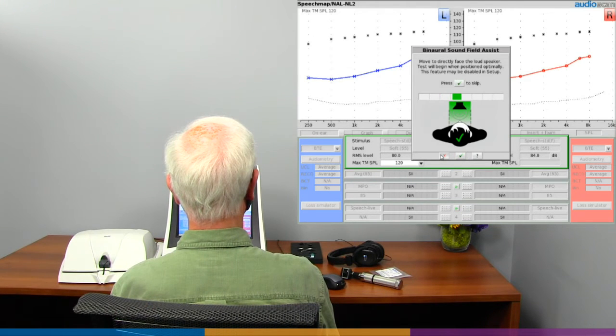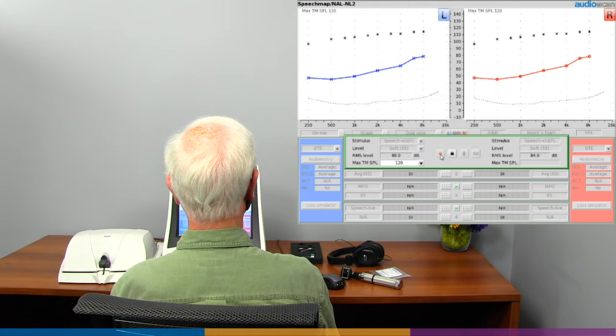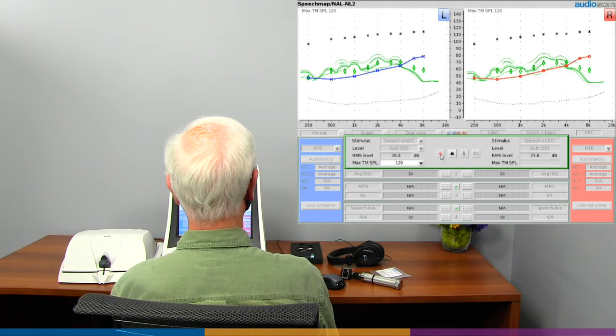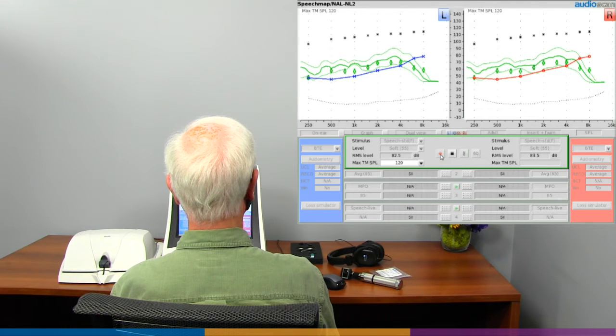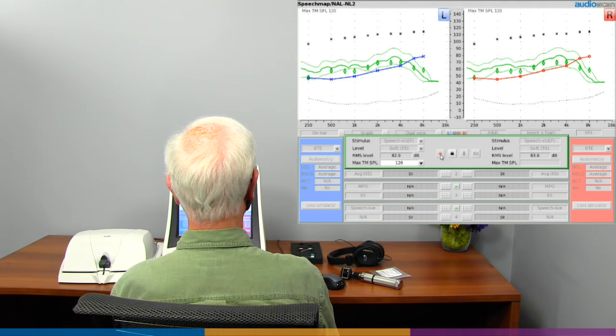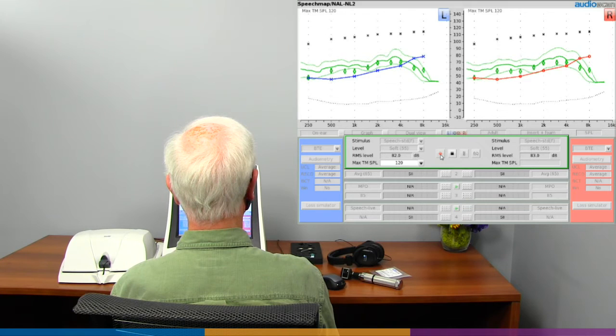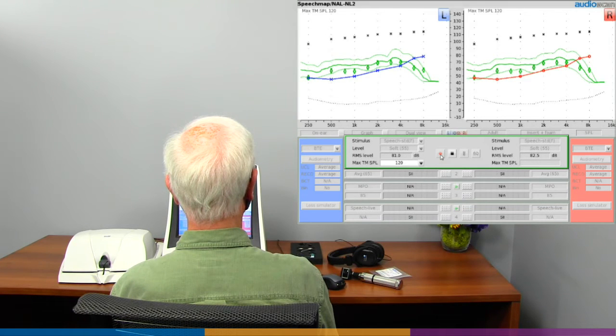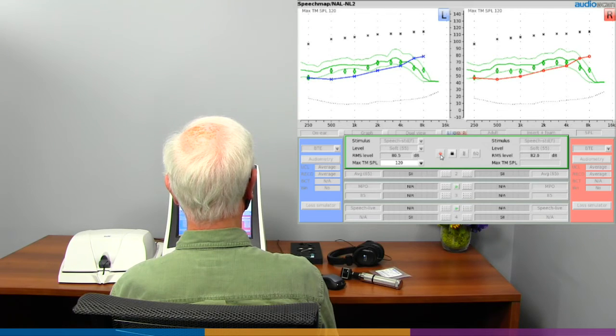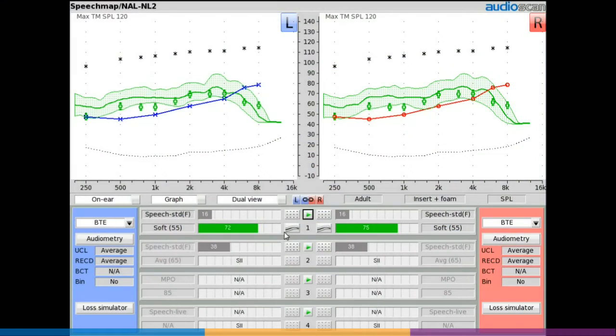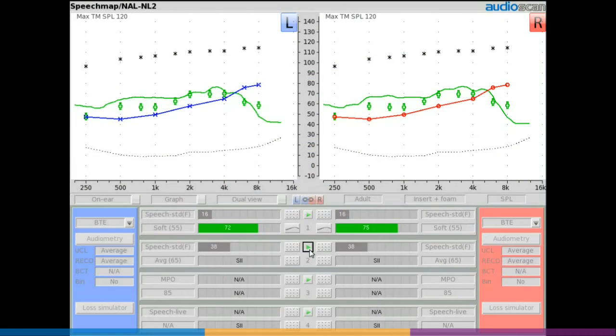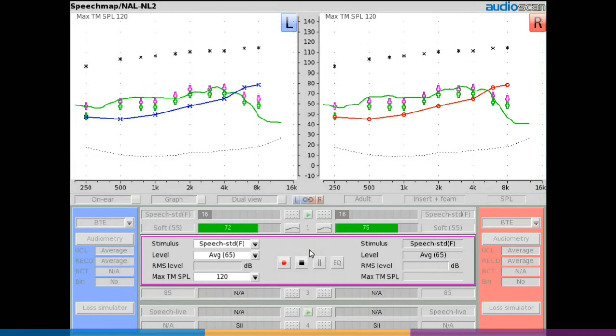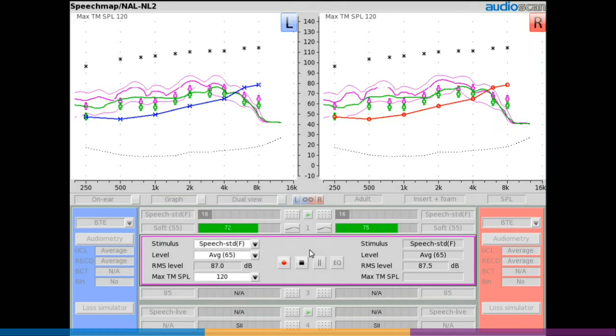Once the patient is optimally positioned, the tool display will turn green. After a one-second pause, the requested real ear measurement will complete automatically. If nothing changes in the sound field, subsequent testing of this patient will likely not require repositioning, and the sound field assist tool will not be shown.